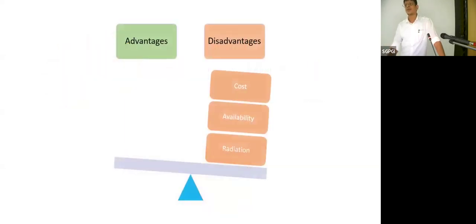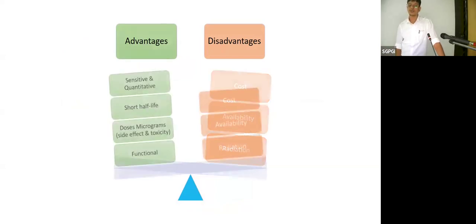First, I will come to the advantages and disadvantages. There are a lot of disadvantages. Radiation, yes, it is there. Availability, it is not available everywhere, and cost may be very high. We charge $150 for a PET CT. So in the Indian scenario, it is not that high, but in the Western world it is actually very high. But we have some advantages also.